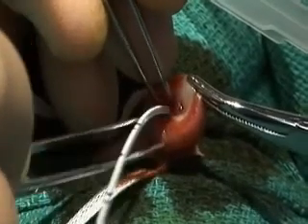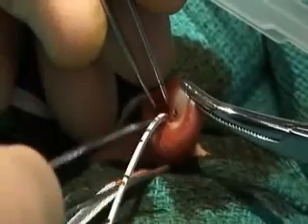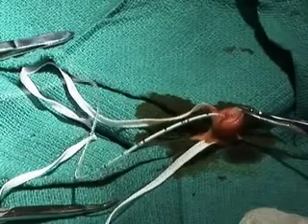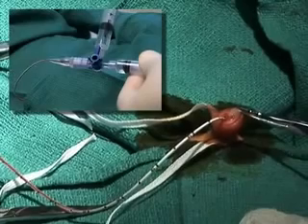Grasp the cephalad portion of the cord with the toothed mosquito forceps and apply traction in the cephalad direction to assist in passing the catheter deeper. Once a depth of 5 centimeters has been reached, draw back on the syringe to ensure the blood is able to flow.